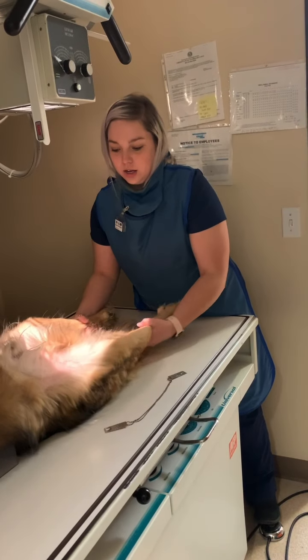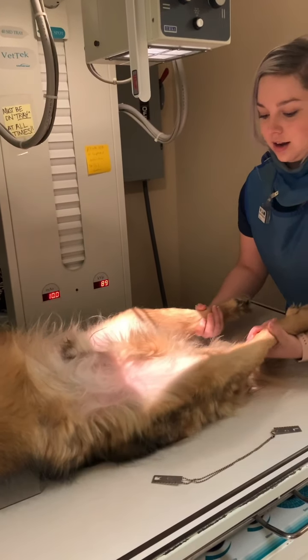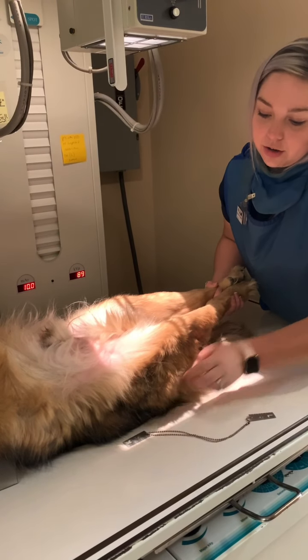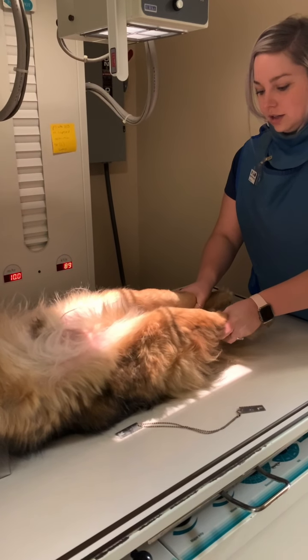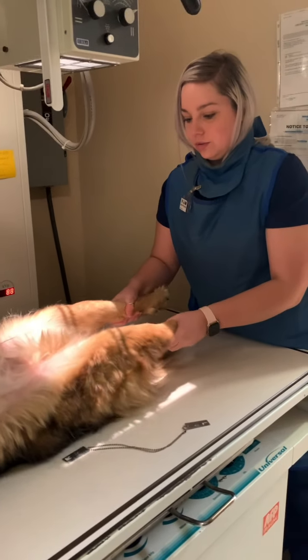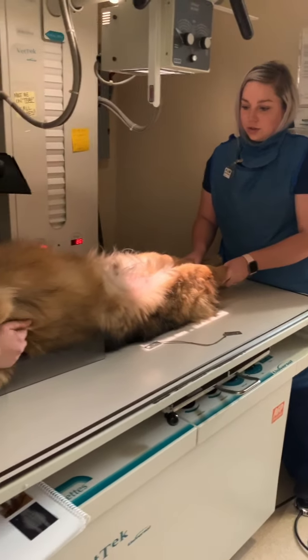Okay, so Christina is my assistant. She's going to pull him as far to her as she can, and then I'm going to make sure his legs are parallel and put the right marker in. You want to make sure that it's just distal to the patellas, and you want to make sure the tail is lined with the spine. So you're going to rotate in the legs, pull towards me. There we go. All right. And then you're going to make the exposure.